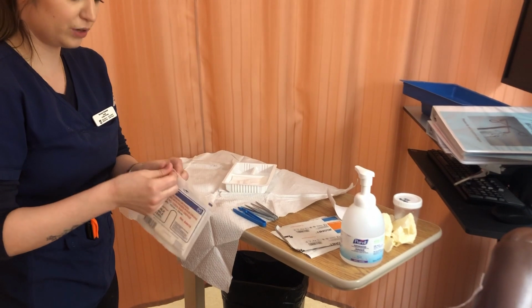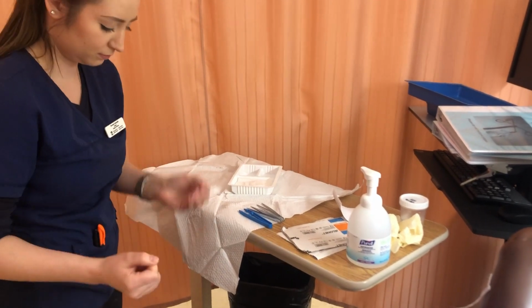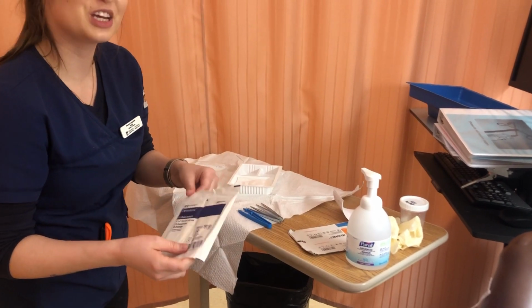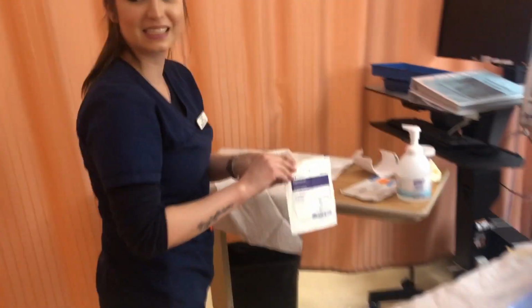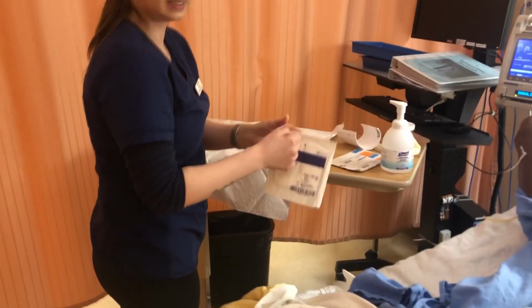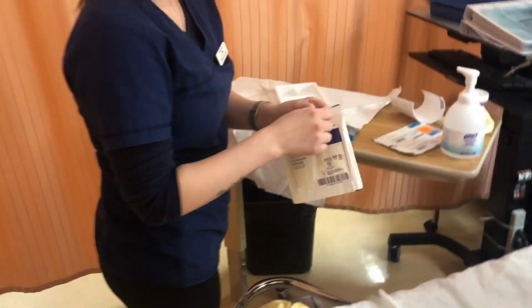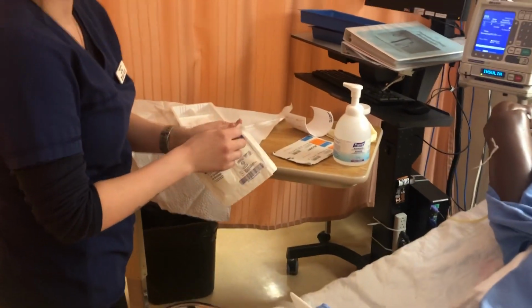I'm going to need some drain sponges. So I would go get a new one. Could you grab me a new drain sponge, camera woman, please? Probably at the table. Yeah.